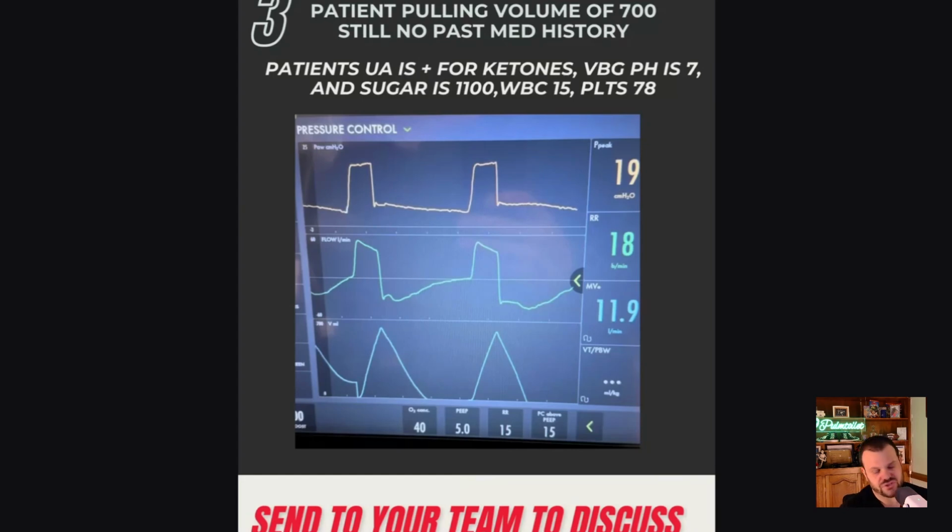So for me, certainly with a patient who's just intubated and has other things going on, I like having the backup rate of pressure control. I'll put it somewhere lower than their intrinsic rate just to get the vent out of their way. So if they're breathing at 18, I'll probably drop that respiratory rate down to like 14. That way the vent doesn't sort of trigger 1 or 2 breaths based on sort of the time period.